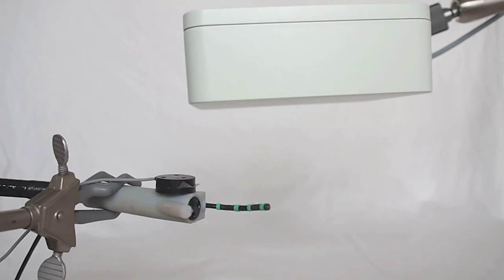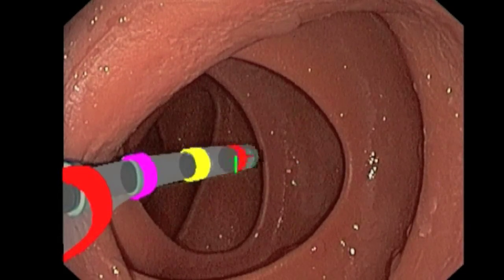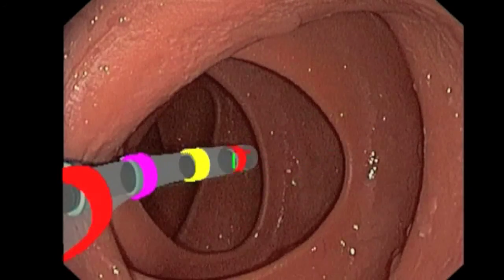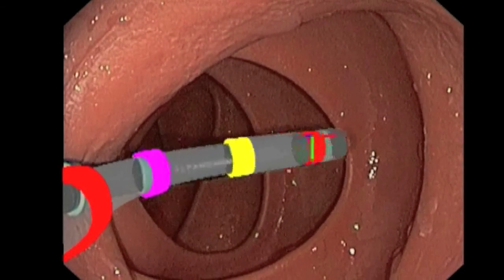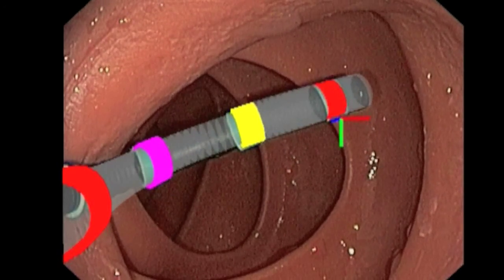The system was evaluated in an anatomical model of a colon. The estimated position was compared with a position measurement from an electromagnetic tracking system, indicated here by the marker. The errors of the position estimation were 2.3, 2.2 and 1.7 mm in the horizontal, vertical and away from camera directions respectively.